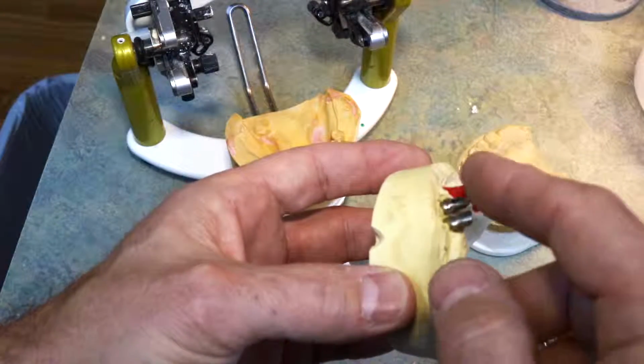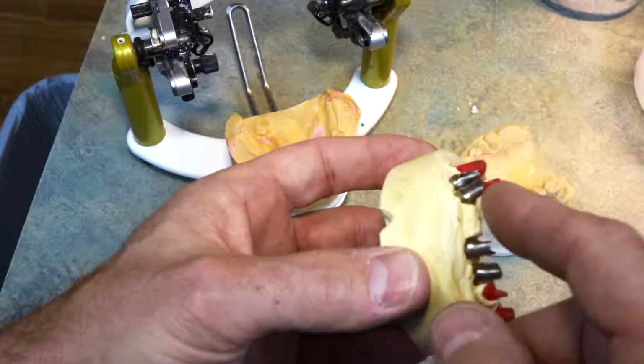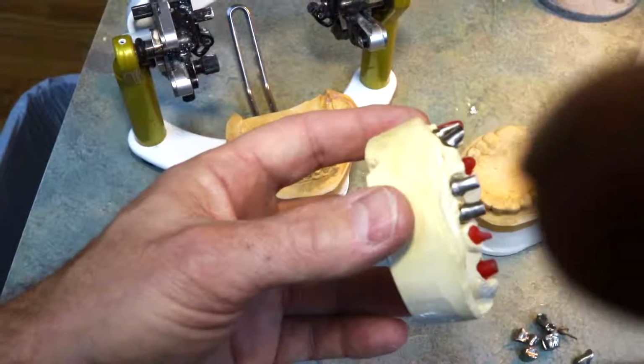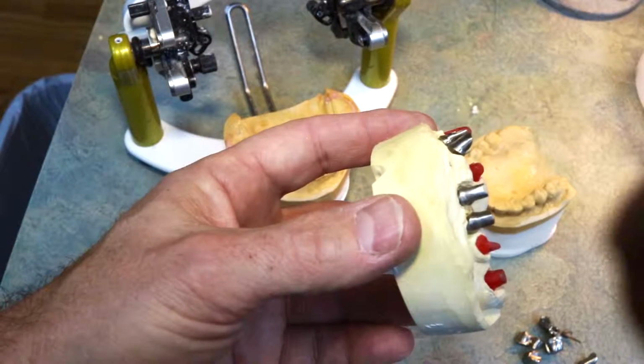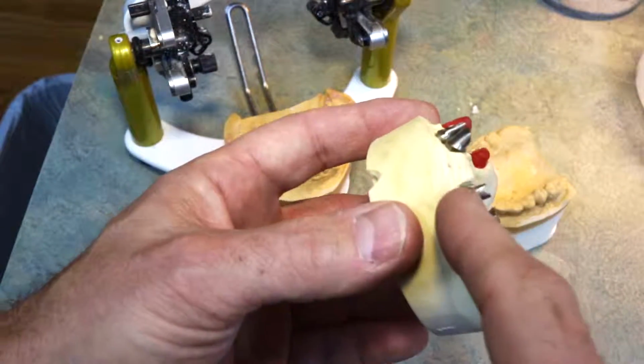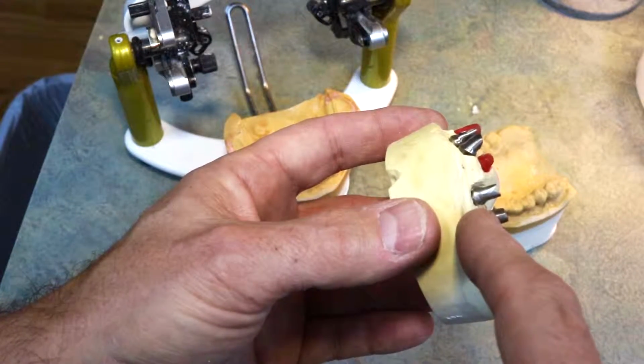The finishing lines were fine-tuned. We got some feedback from the crest of the gingiva, and I have, see if I can focus this. I have adjusted the finishing lines labially on these so that we're going to be about 1 millimeter subgingival.